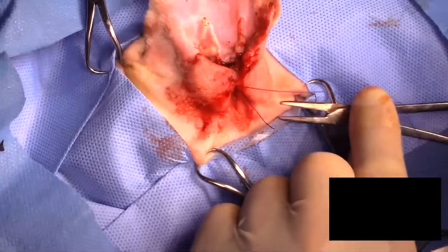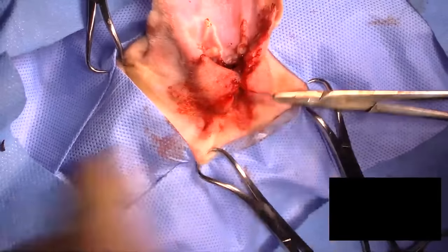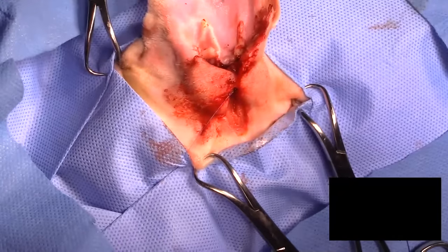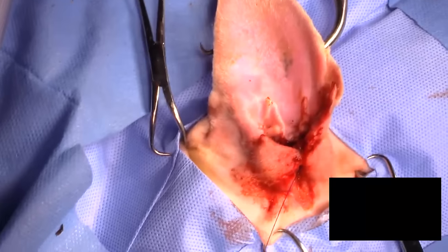So we're also going to do some lubrication of the eye in case we have facial nerve palsy, although as soon as we can establish that the facial nerve is working and we've got a blink reflex, we can discontinue the lubrication of the eye.